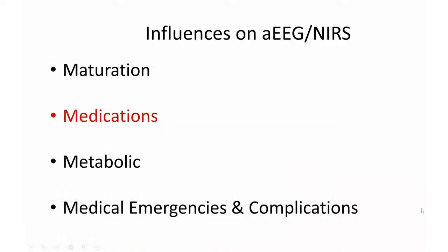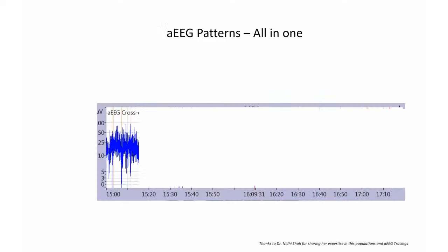So medications are hugely influential on our aEEG. And I like to look at this one here. This is actually a baby who was undergoing anesthesia.